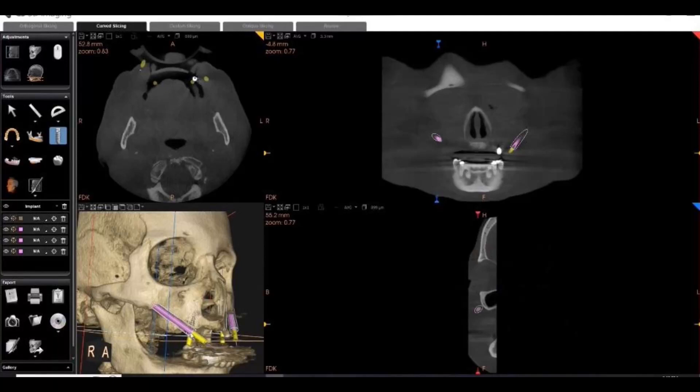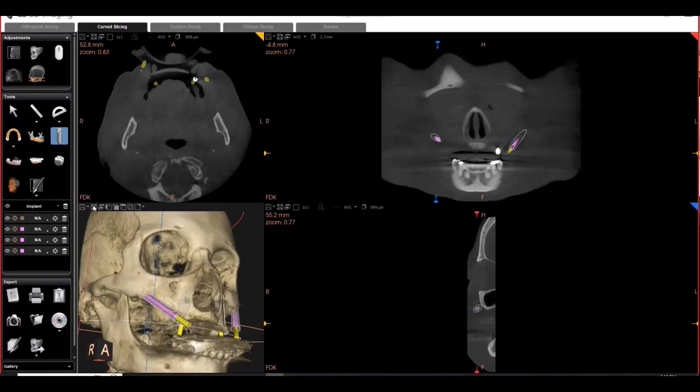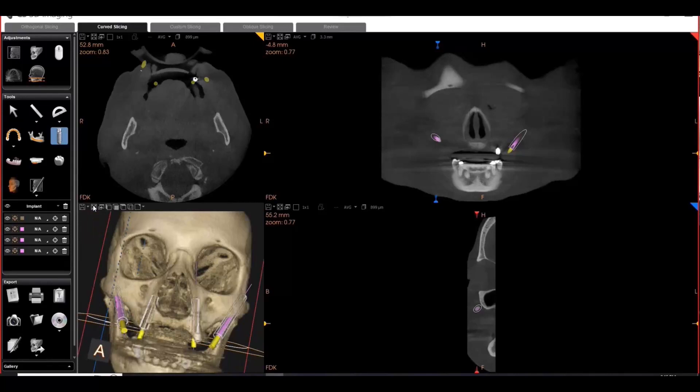I recorded this session because I thought it would be instructive for others, but we wanted to keep it anonymous. So I removed all the audio and I'm just talking over it and kind of showing you what the surgeon did. The video is actually the surgeon manipulating the scan because I wanted that to be intact. So at first, this is what the surgeon was planning and he was kind of having a hard time with the software manipulation and getting the implants exactly where he wanted them.